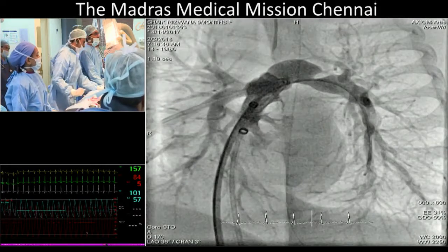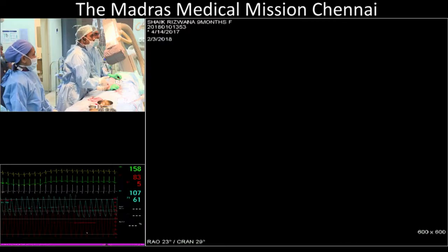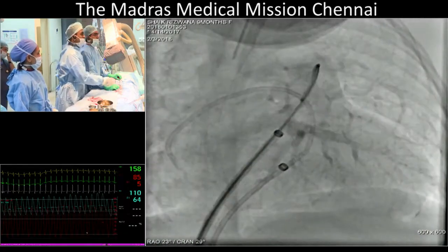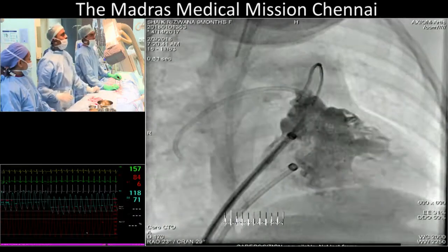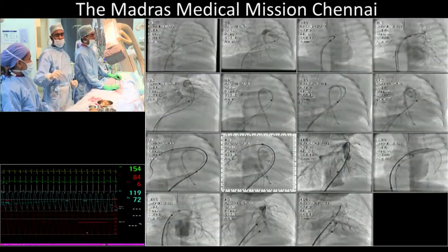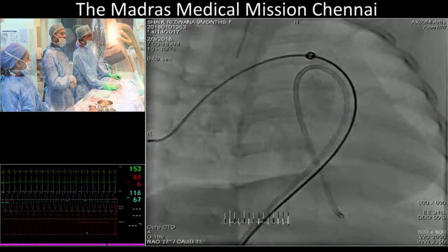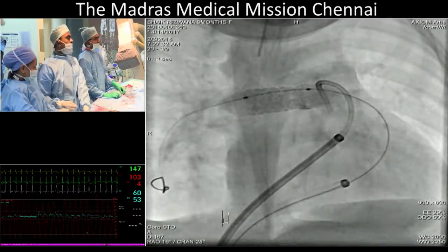So we're just going to go back to the other lab again and then come back to you whilst you decide what to do. Okay, now this is the right. Freeze the right. All right, let's have a look at the right. Yeah, so I would accept the right. We'll come back to you. Okay, deflate. Yeah, we're back with you now.